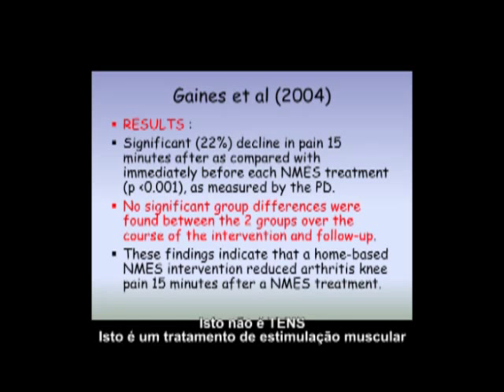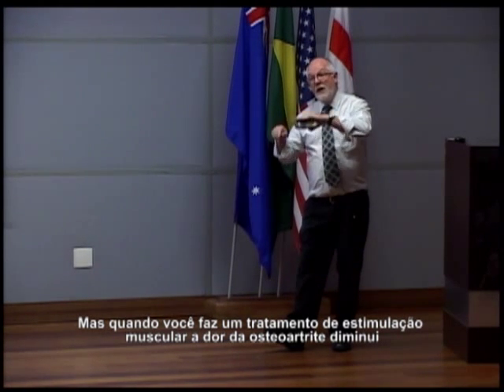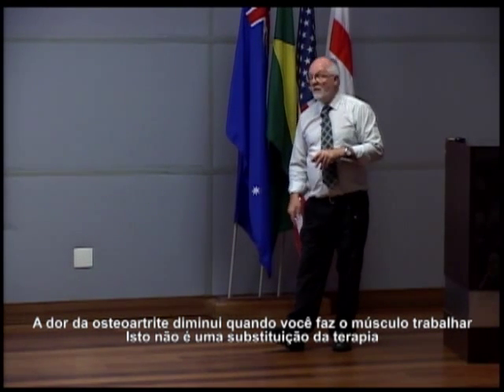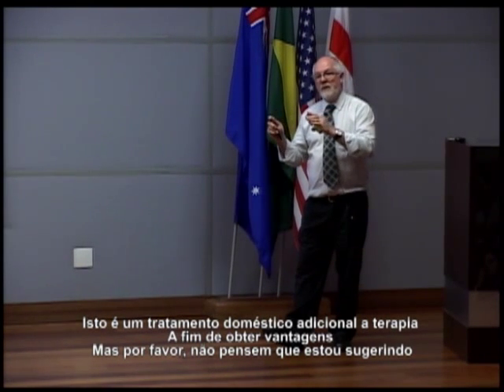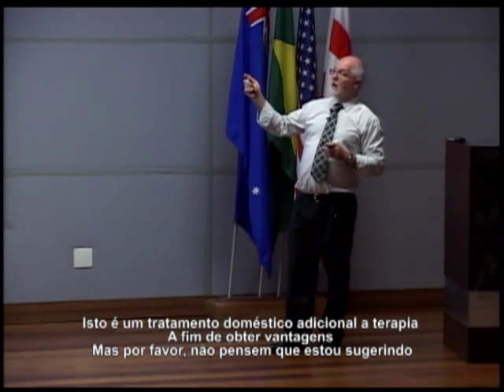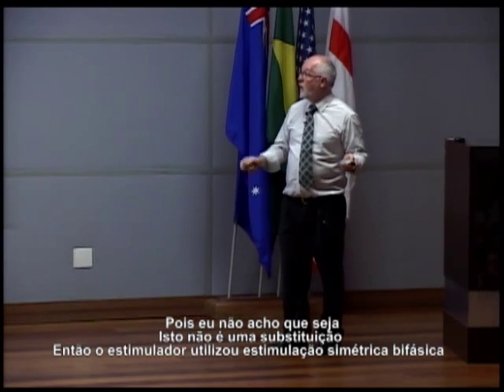So this is not TENS. This is a muscle stimulating treatment. But when you do a muscle stimulating treatment, the pain in OA knee reduces. The arthritis knee pain reduces when you make the muscle work. This is not a replacement for therapy. This is a home addition to therapy in order to gain advantage. But please don't think that I'm suggesting, and don't think that anybody is suggesting, this is a replacement for physical therapy, because I don't think it is. It's not a replacement.